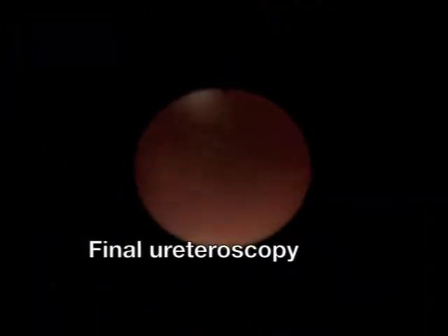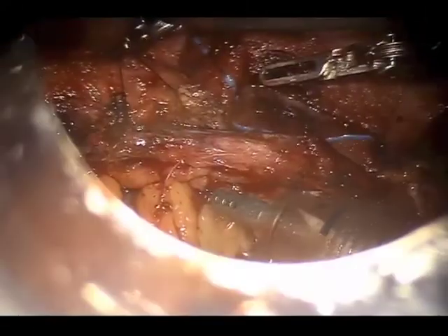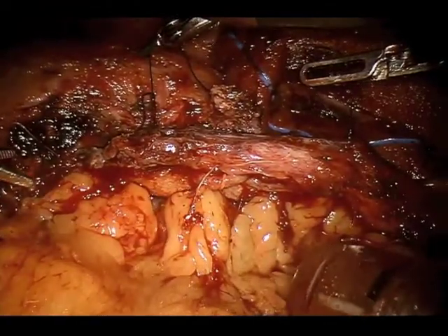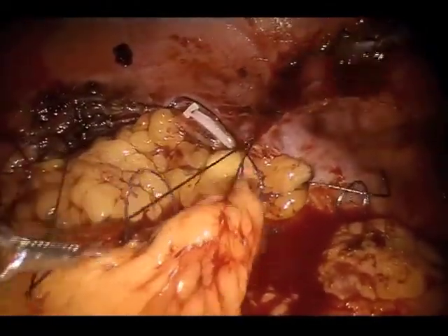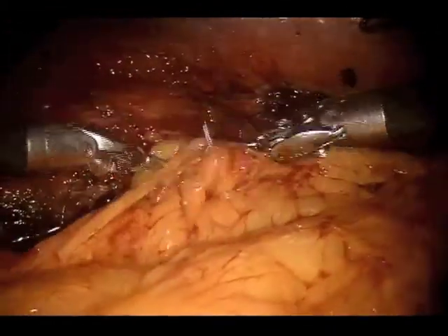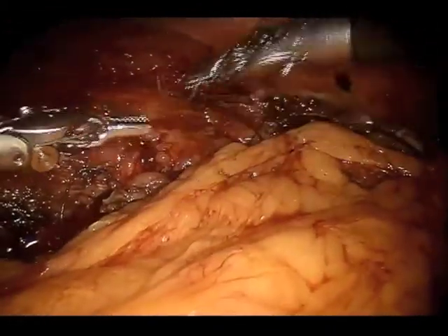With the anastomosis complete, the flexible ureteroscope passed easily, and minimal leak was detected from the pressurized irrigation. A double-J stent was advanced into the left kidney. The omentum was then wrapped around the anastomosis, and a periureteral Jackson-Pratt drain was placed.